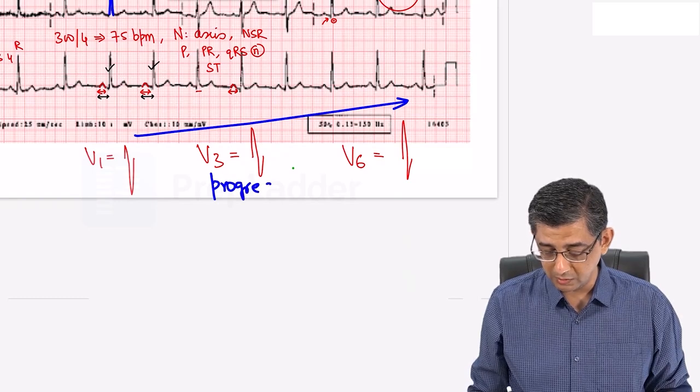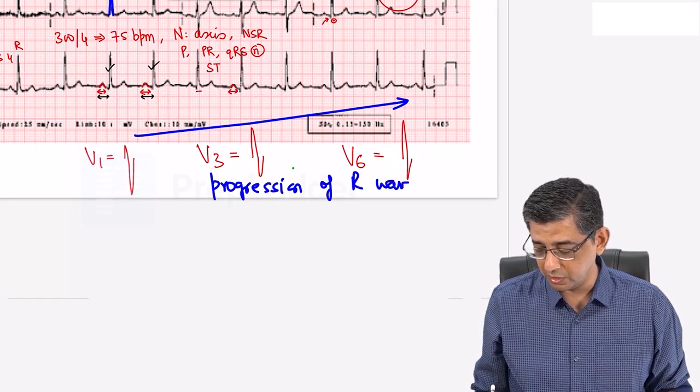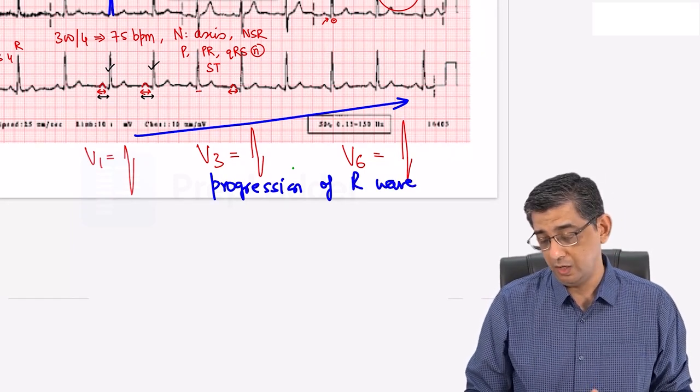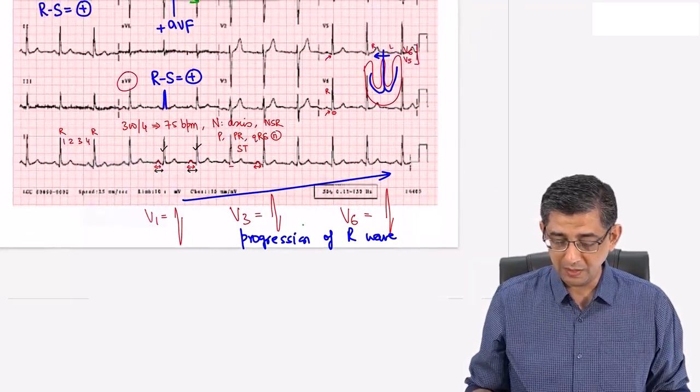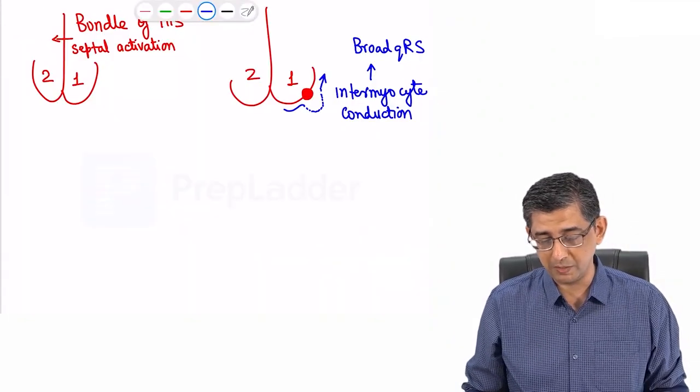But you will notice that in all ECGs of bundle branch block, this normal progression of the R wave will definitely be hampered. Once you have a hang of identifying these baseline parameters, we will now look at what is the problem for my patient.